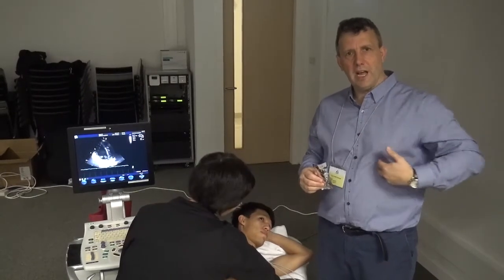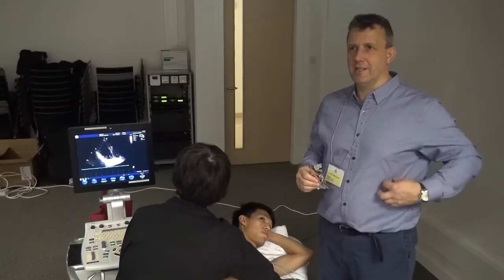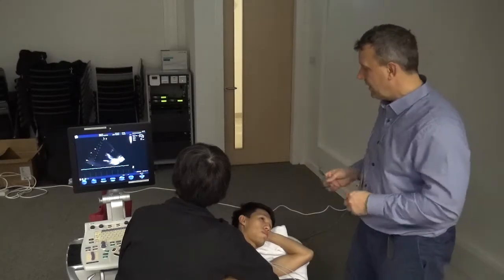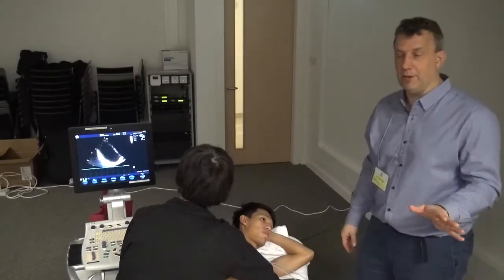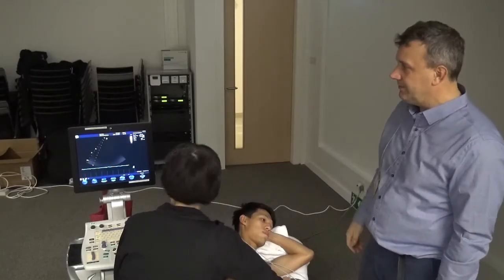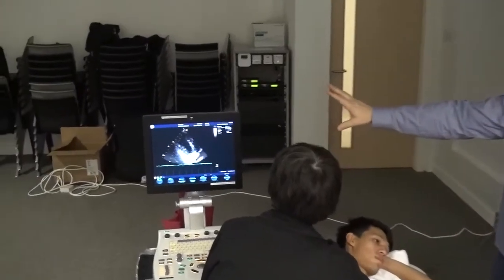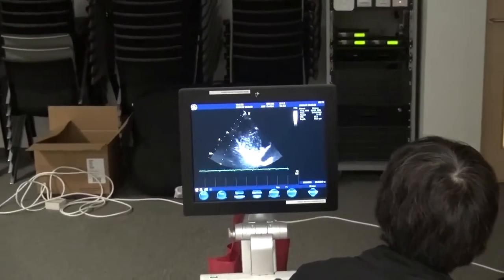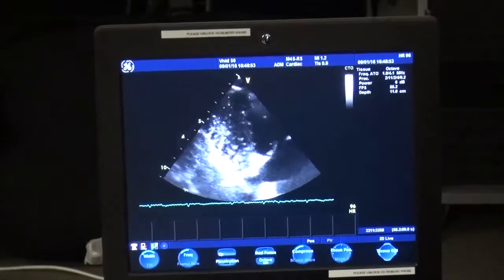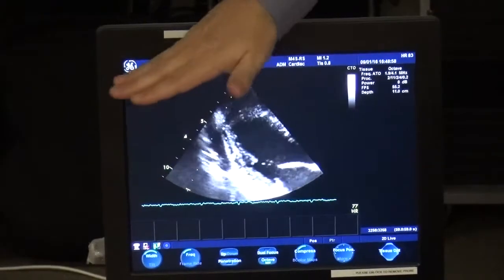When you go for the apical window, you've got much more chance to make an error because you've got a bigger area to work with. So you've got to do a little bit more work with the apical window. Classically, you put the transducer on again. You're seeing something, that's fine, it's a heart. So you're roughly in the right area, but it's clearly not what you were expecting to see. You're expecting to see septum running straight down the middle, left ventricle over here, right ventricle over here.